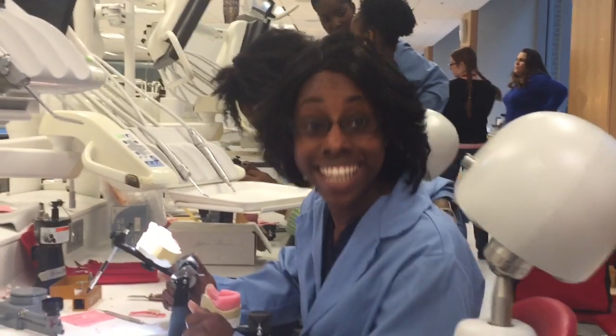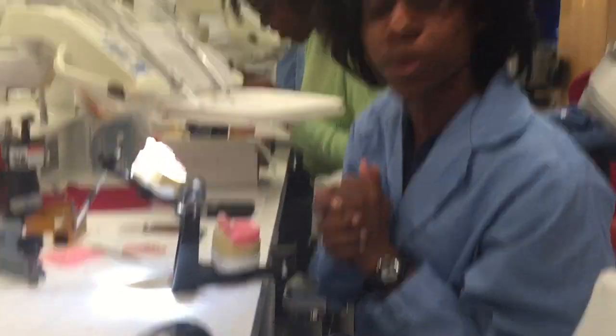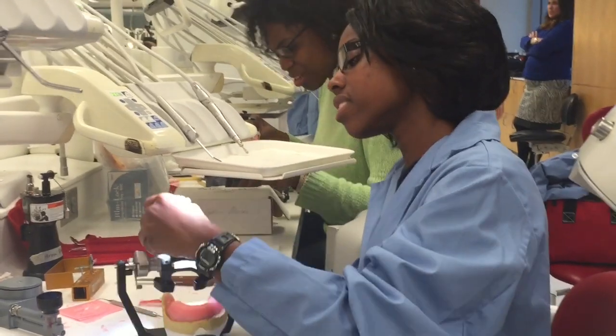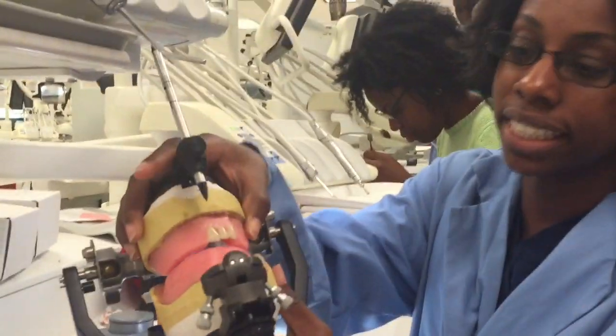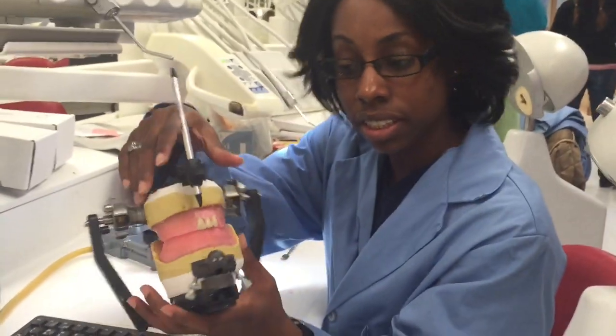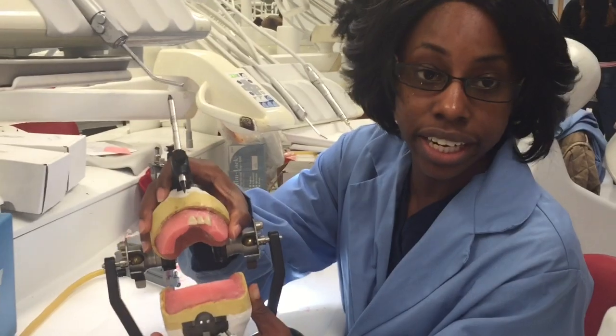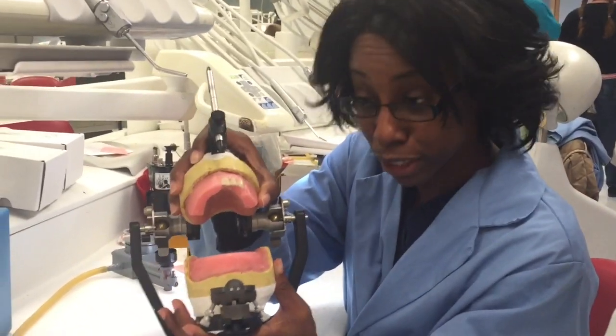We have class in T-minus two minutes, but there are people who are still here. I'm working on smoothing the anterior teeth on the left side of the patient. It is nowhere near where it needs to be, but that's okay because I'm learning — that's the whole point. Bye, YouTube.